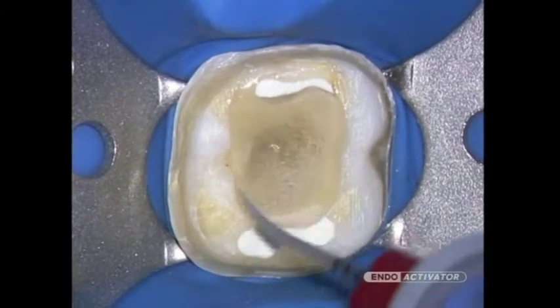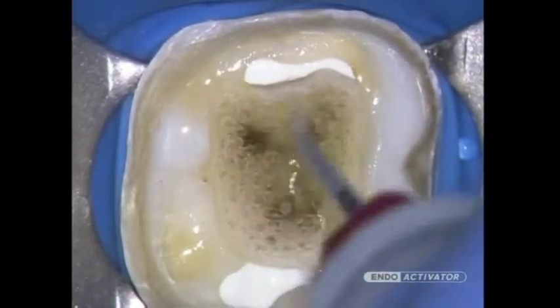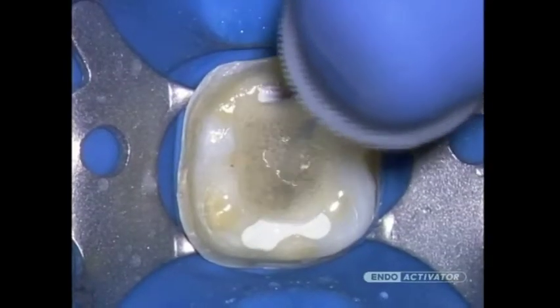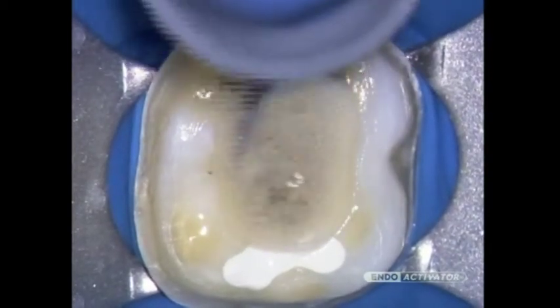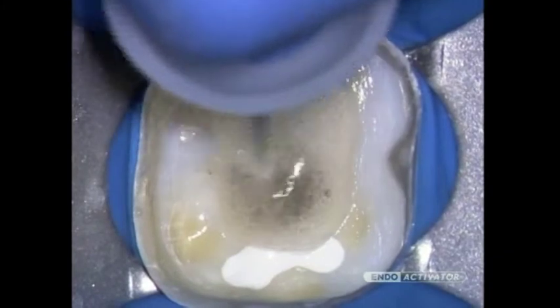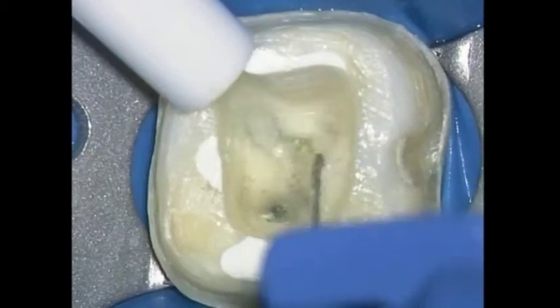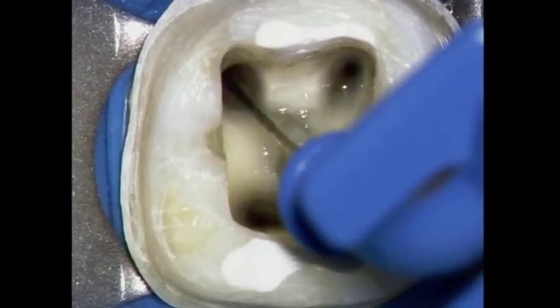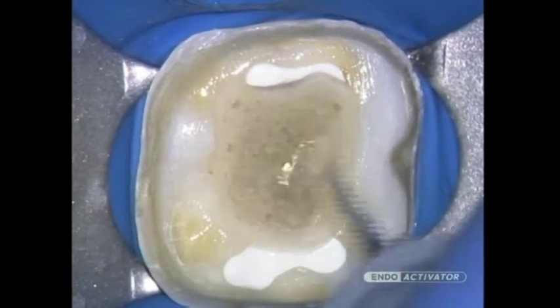In fully prepared canals, select the tip that fits loosely and to within 2 millimeters of working length. Move the vibrating tip up and down in short 2 to 3 millimeter vertical strokes to optimize a powerful hydrodynamic phenomenon. In general, use 10,000 cycles per minute to encourage debridement and promote the disruption of the smear layer and biofilm. During cleaning procedures, agitate the intracanal solution for 30 to 60 seconds, then irrigate and use intracanal suction to remove loose debris. This process should be repeated for each intracanal irrigant used.